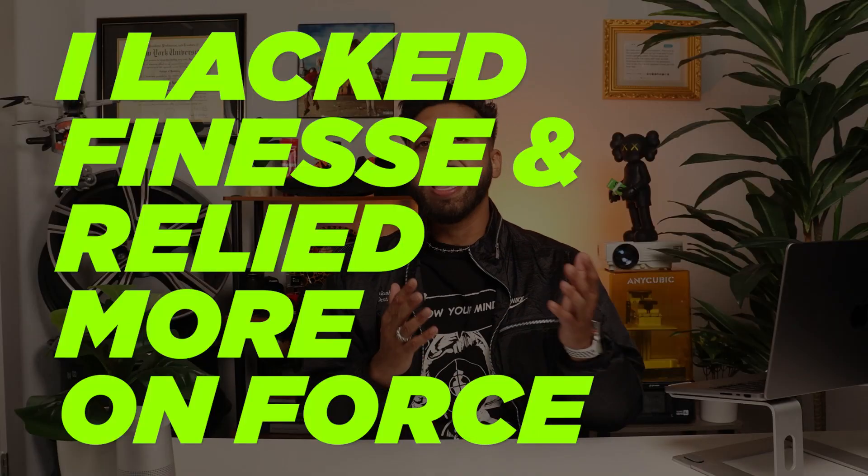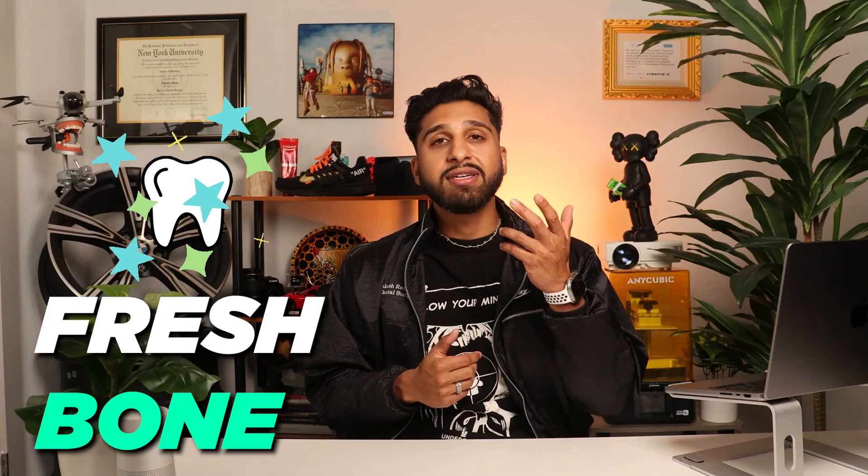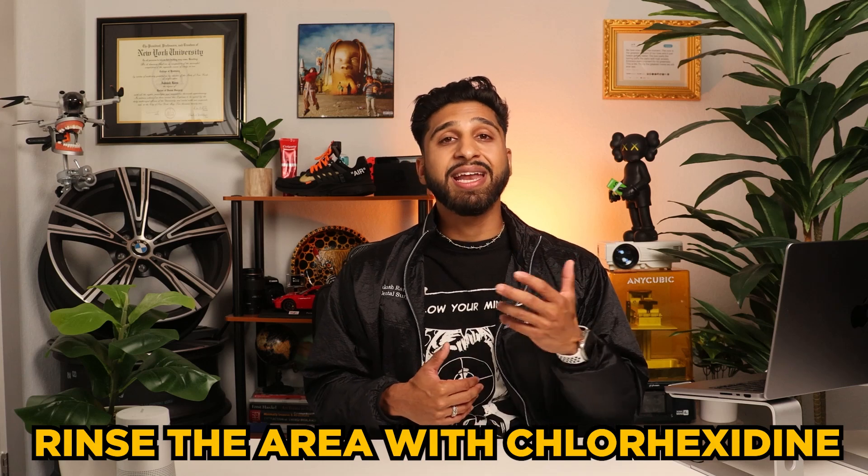I focus on using finesse and minimizing trauma, steering away from forcefully extracting teeth. Now, in the early stages of my career, I lacked that finesse and relied more on force. However, now I do the best of my ability to make the procedure as atraumatic as possible, aiming for cleaner surgeries without excessive force. Nowadays, I carefully smooth out the walls of the socket using a bone file or a burr to shape the ridge corners, ensuring there are no bony spicules. I'm also removing that top layer of damaged bone, which allows for better healing and a fresh superficial layer of bone for better blood flow. Then I thoroughly rinse out the area, eliminating any remaining fragments that may be left in the flap or the socket.